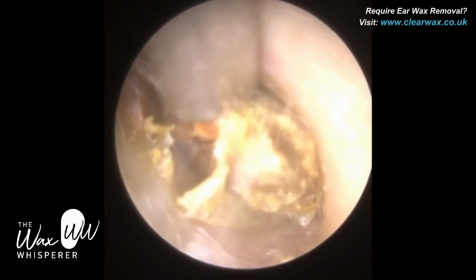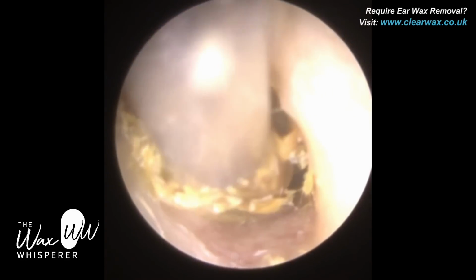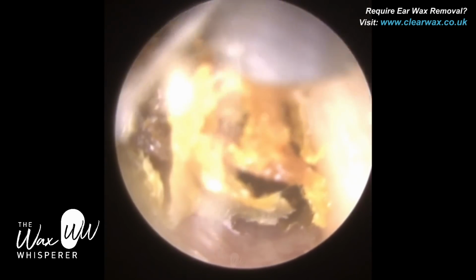So the wax in both ears is a bit hard, a bit dry, and a bit of keratin. You can tell by the reflection we're getting back. When you've got hard, dry wax with some keratin, you do get a reflection back from the light source which illuminates the ear.